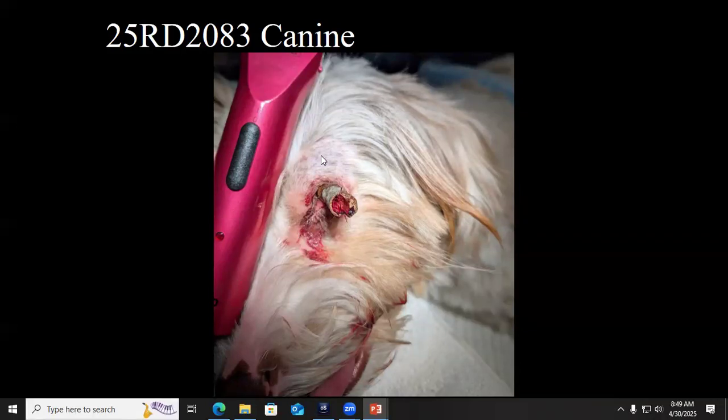But the elephant in the room, I guess, as Megan would put it, is this giant stick that is pointing out towards us in this left globe in this young dog.